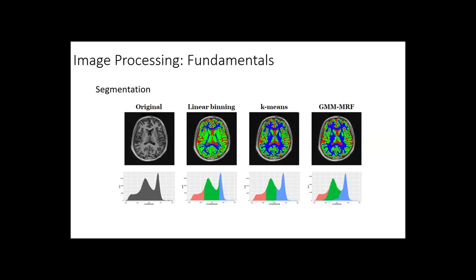We're going to try to replace this gray matter with white matter, and see if by doing so I can reduce the energy function. So the reason we add this random field is to encourage the spatial smoothness. So we're doing the smoothing.